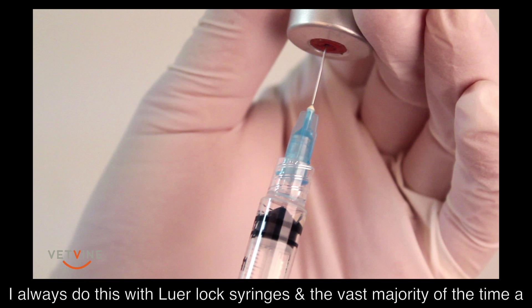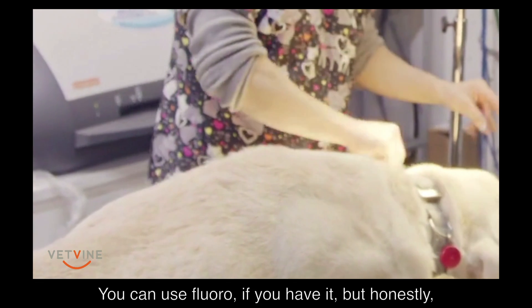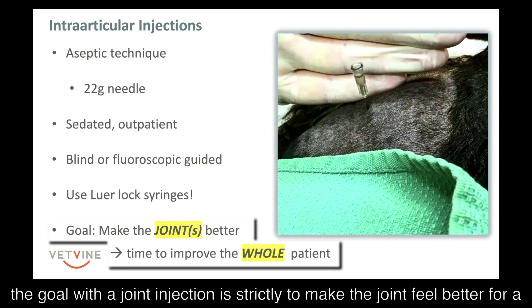I always do this with luer lock syringes and in the vast majority of cases a 22 gauge needle. They're always sedated on an outpatient basis. You can use fluoro if you want, but honestly if you just get joint fluid out, you know you're in the joint. Remember, the goal with a joint injection is strictly to make the joint feel better for a period of time.